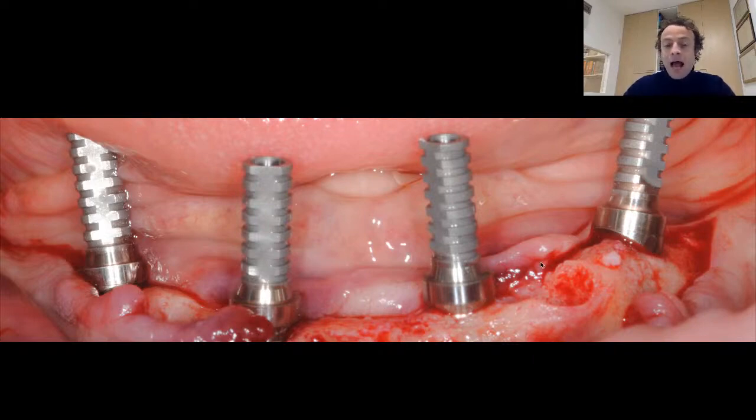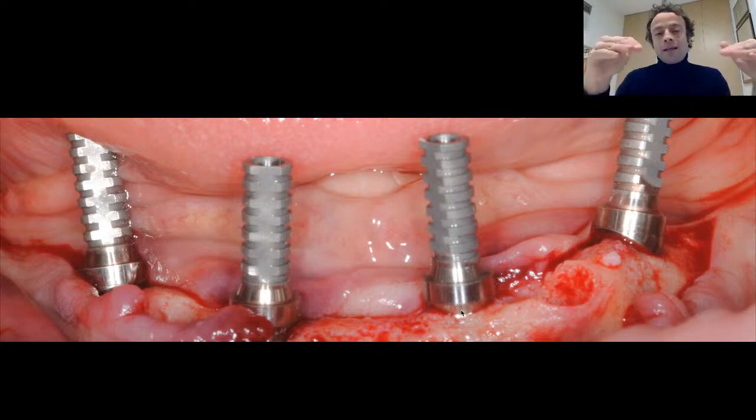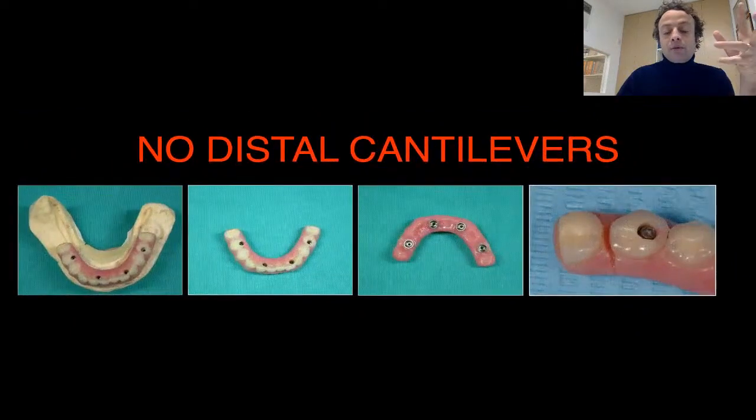So I never work at implant level in this situation. Today I love to work always at prosthetic level, and I always like to work with intermediate abutments that are placed immediately during the surgery and that move my prosthetic platform more coronal. In that way I can simplify my approach and also the life of the patient.